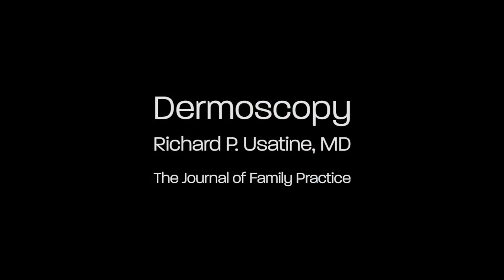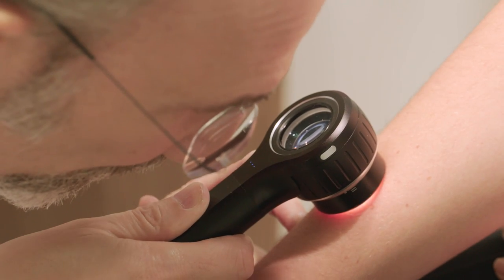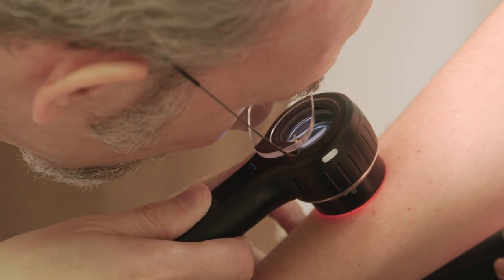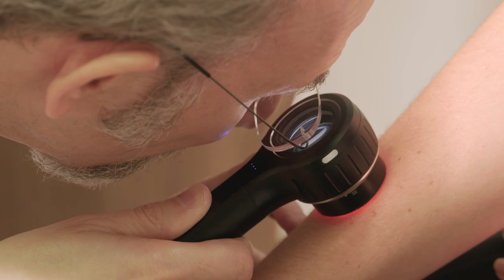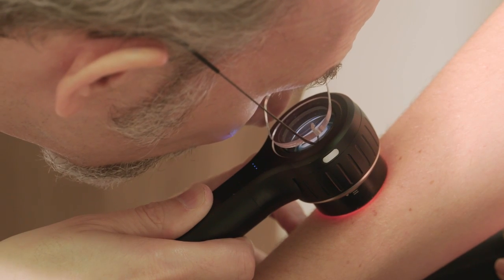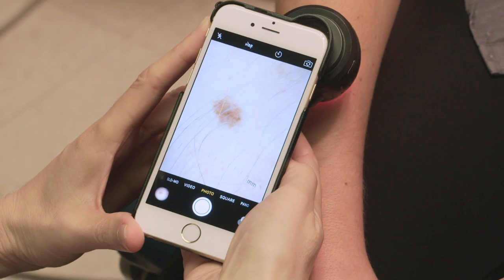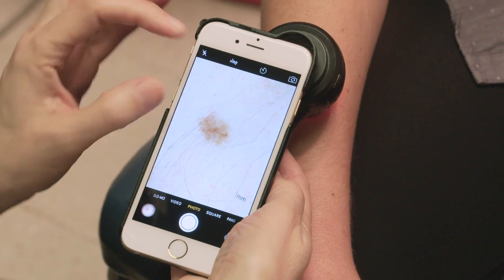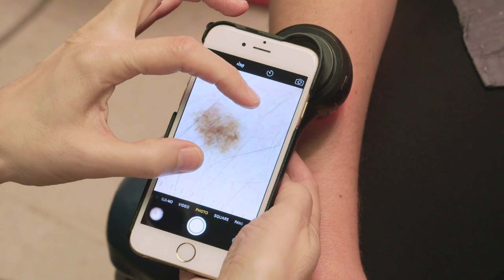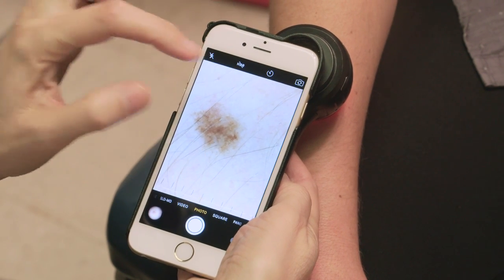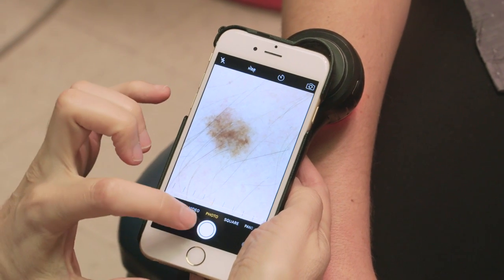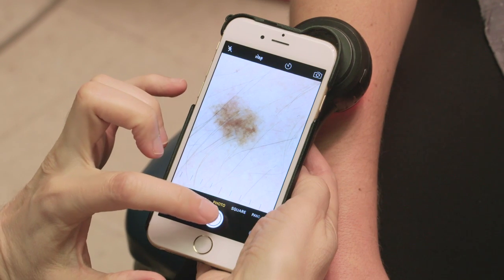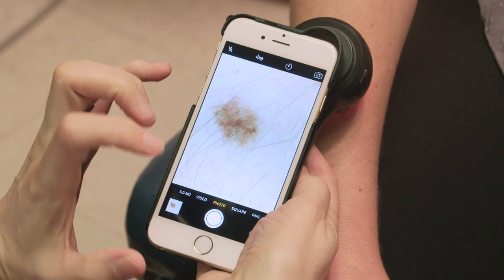Today we will demonstrate the use of dermoscopy. Dermoscopy is a state-of-the-art method for diagnosing all kinds of skin lesions and skin conditions. A dermatoscope allows you to see into the skin, below the epidermis, and into the dermis.